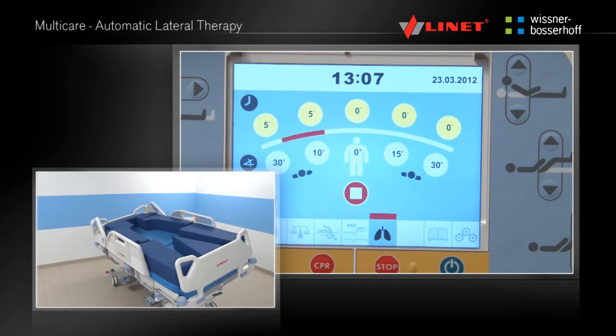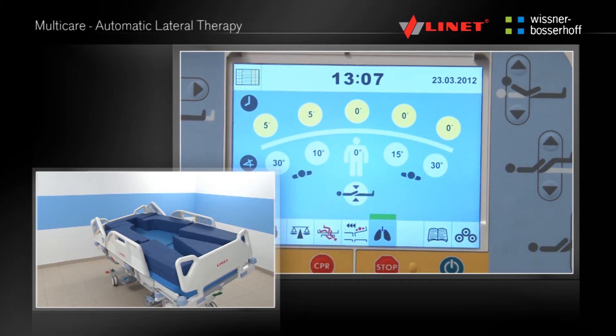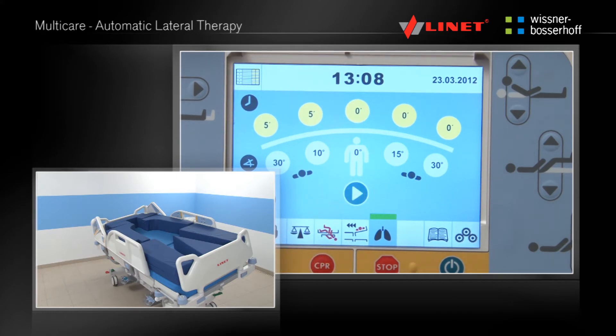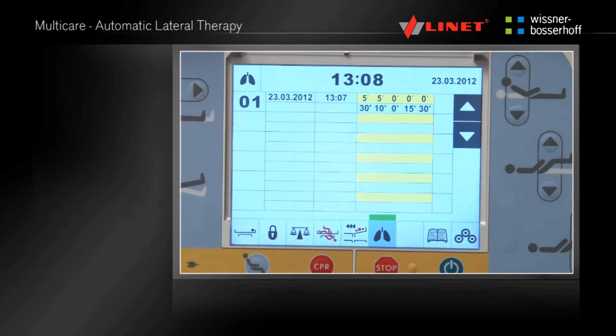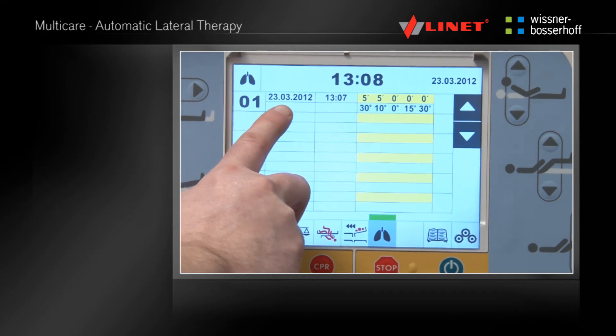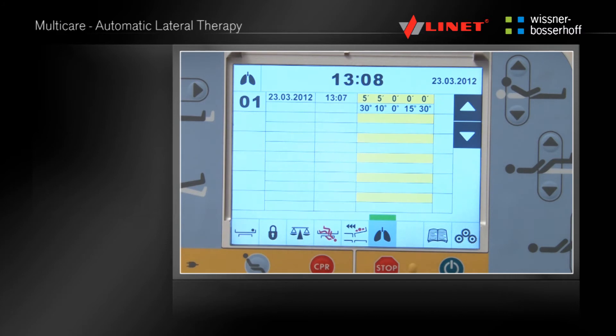The ALT can be stopped at any time by pressing this button, and by pressing the play button again the ALT can be resumed. The history button when pressed will show data recording time, date, angle and number of cycles. The history can be searched by using the arrows. To leave this history press the lungs button.